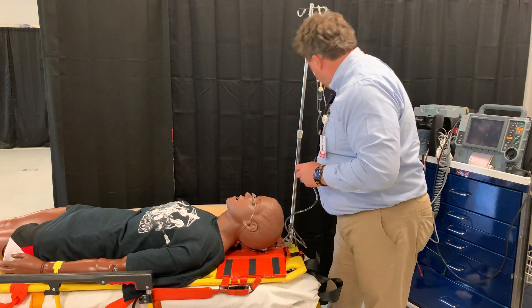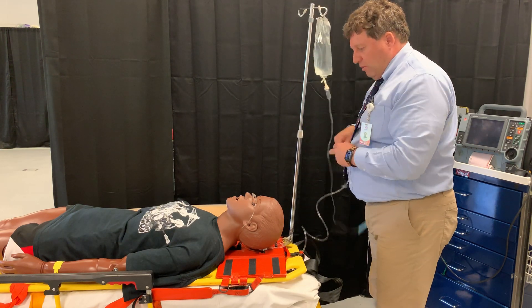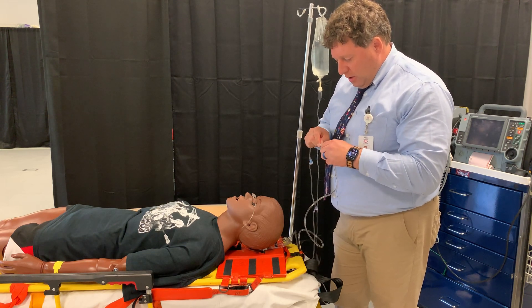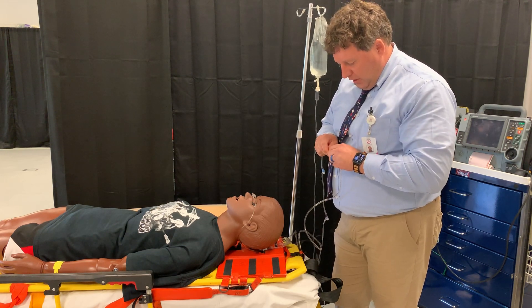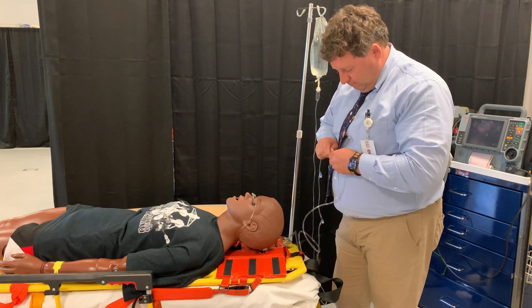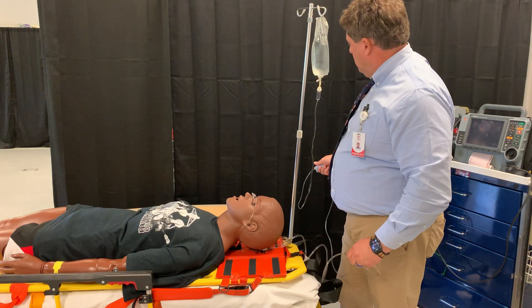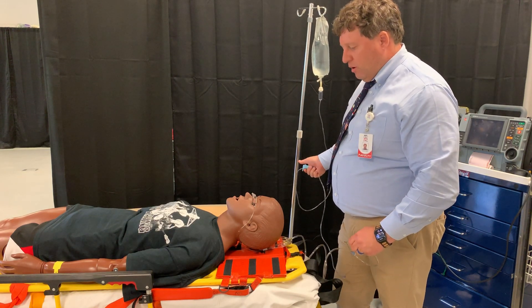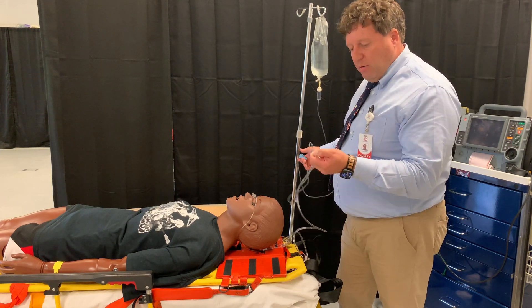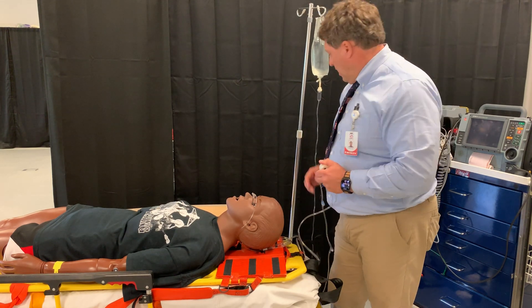Another trick is if you have a bag of saline — and this may not work for EMT students — you can usually get the saline bag to fit into the nasal cannula pretty snugly, and then you can run your saline and it will flow and wash the eyes out from the center of the face outwards. If you're having a hard time holding this together, you can just use some tape to tape them together and rinse the eyes.